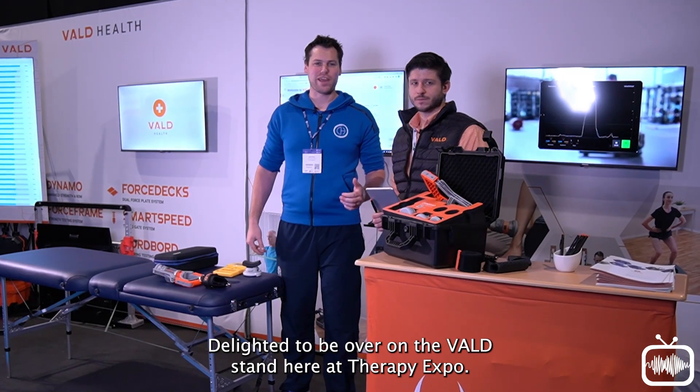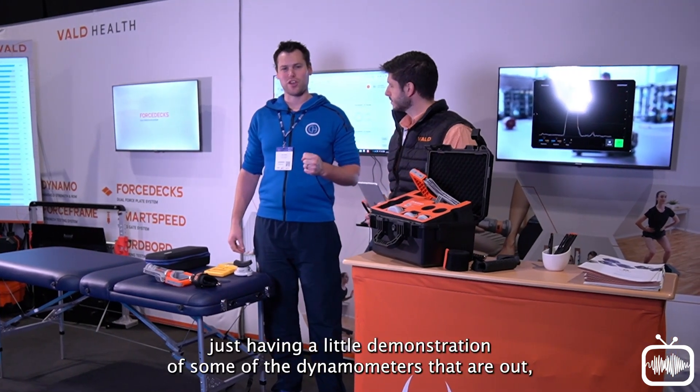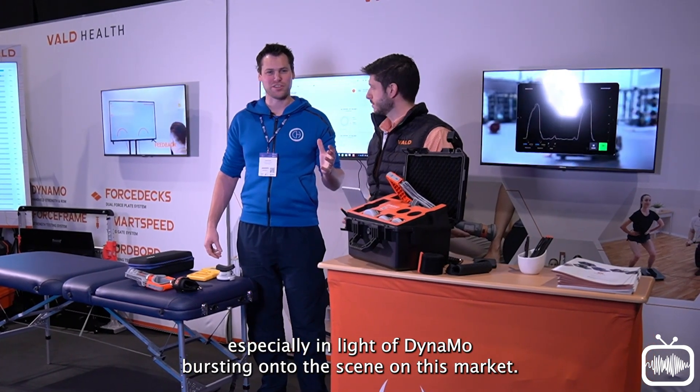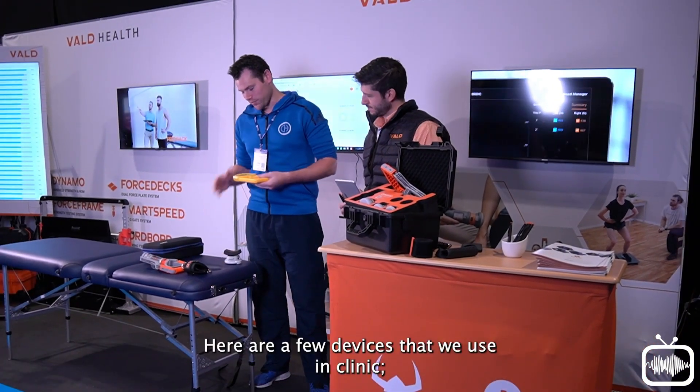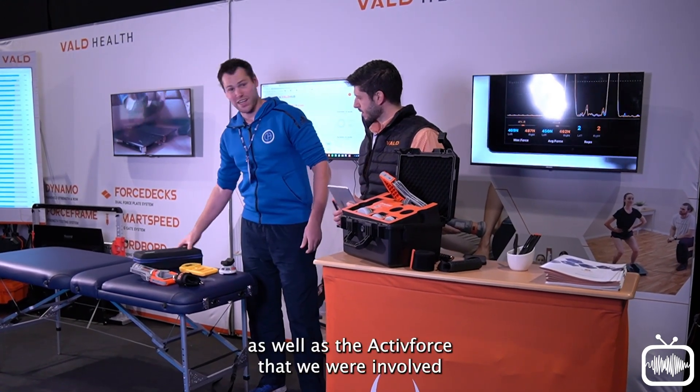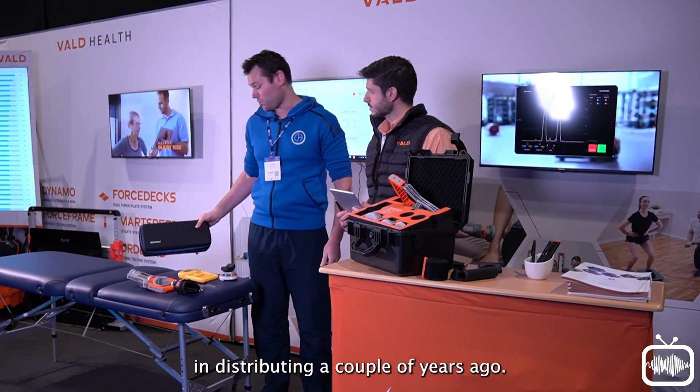Delighted to be over on the VALD stand here at Therapy Expo. We're going to be having a little demonstration of some of the dynamometers that are out, especially in light of Dynamo bursting onto the scene on this market. Here are a few devices that we use in clinic: handgrip, the Microfet for a push dynamometer, as well as the Active Force that we were involved in distributing a couple of years ago.